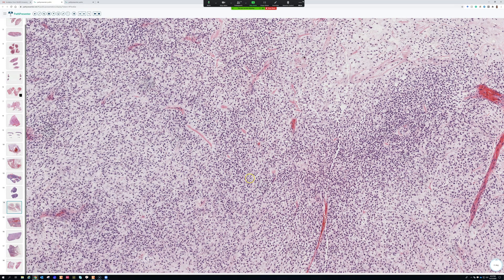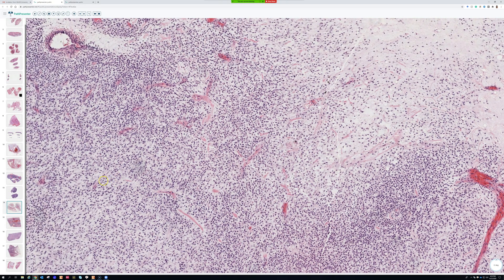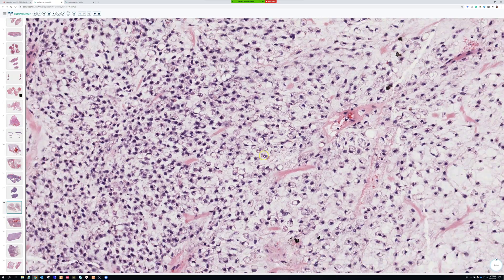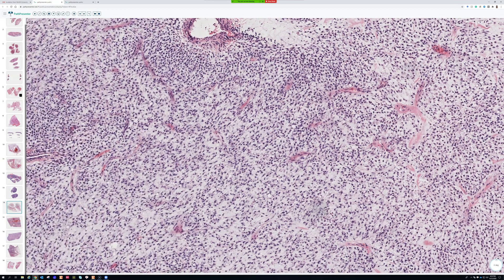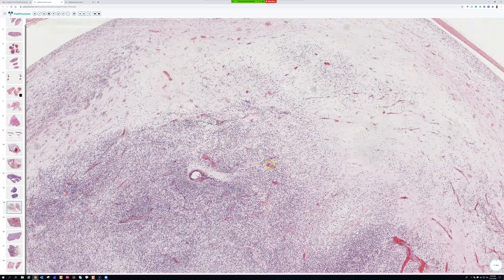If you see necrosis or more than five percent of the tumor with round cell morphology, that's when you make that diagnosis. On a needle biopsy, this is very problematic because you often won't know if you've sampled that component — although skilled musculoskeletal radiologists can sometimes find the area that looks more cellular and target it, which is really helpful. Some of these cells are very vacuolated; I've seen high-grade round cell myxoid liposarcoma with prominent vacuoles and even brown fat-like areas.